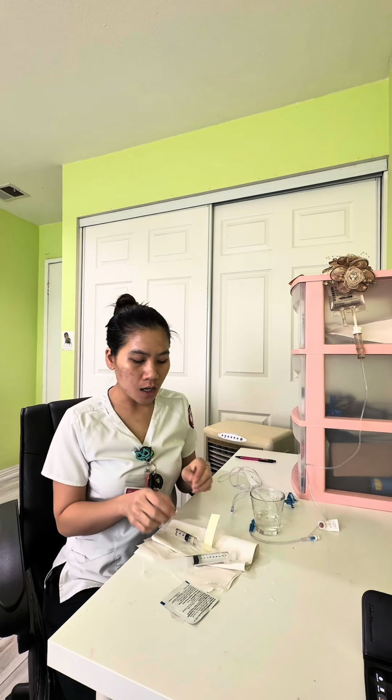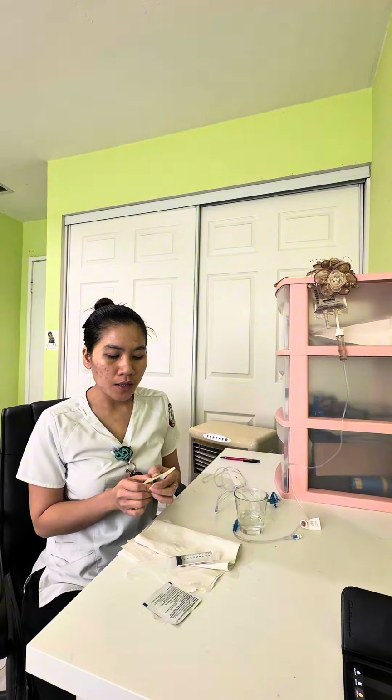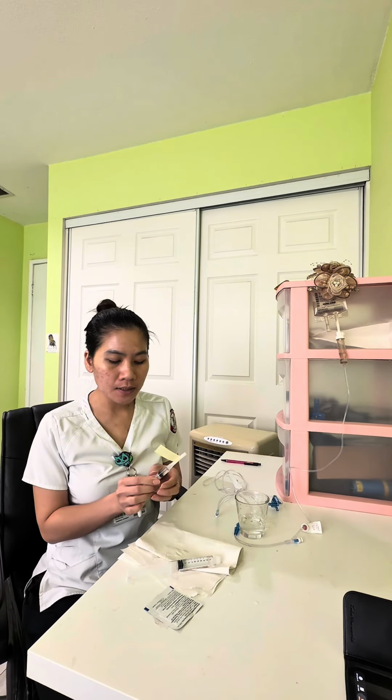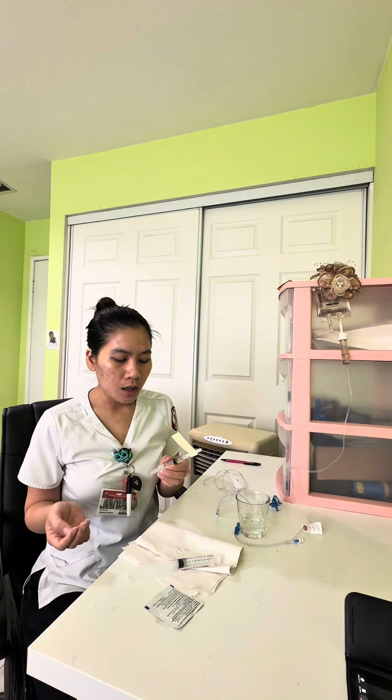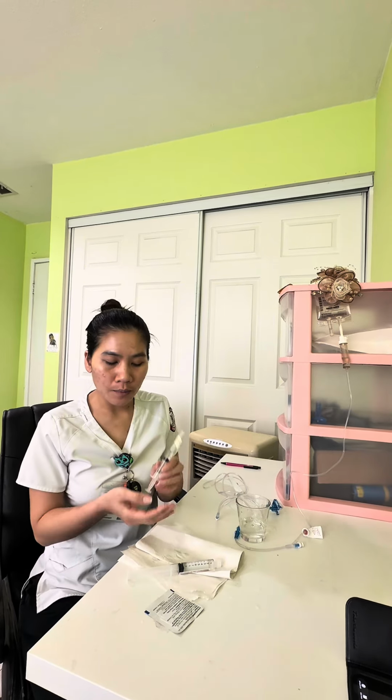Hi, so right now I'm going to perform the IV push with the running incompatible solution. The medication I'm using today is furosemide, 20 milligrams. The available is 10 milligrams per 1 milliliter, so I draw 2 milliliters, and also label it.